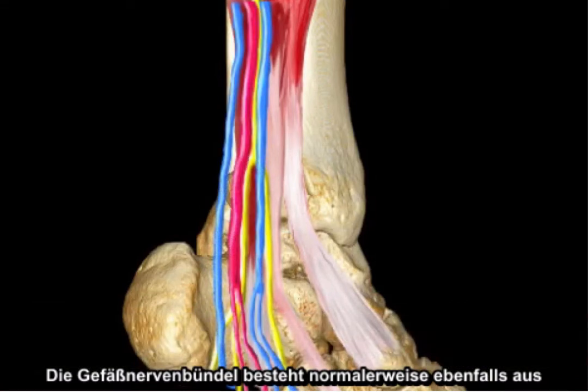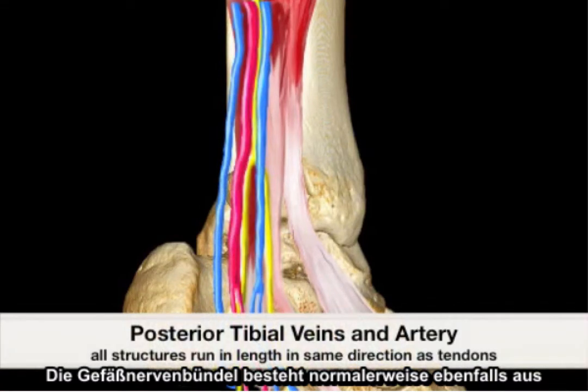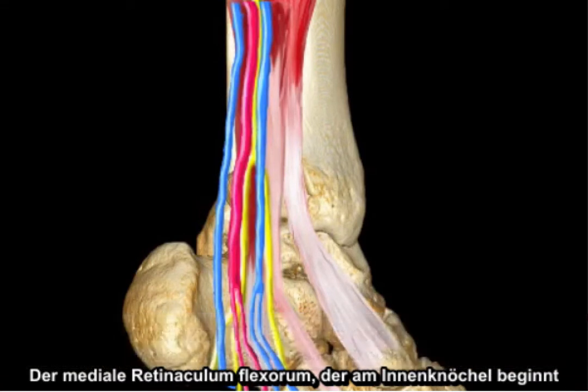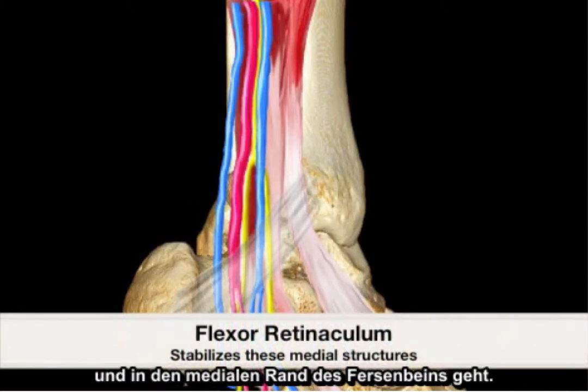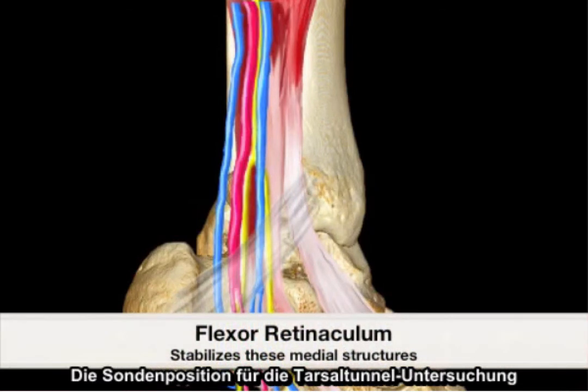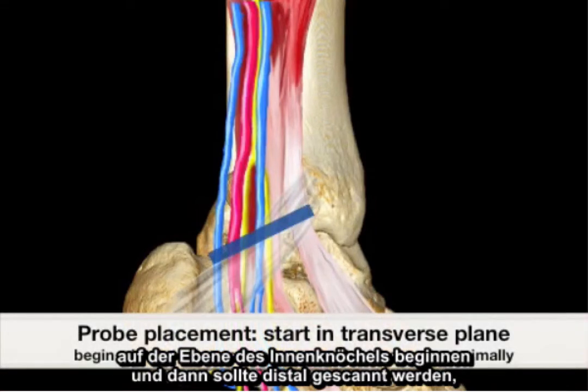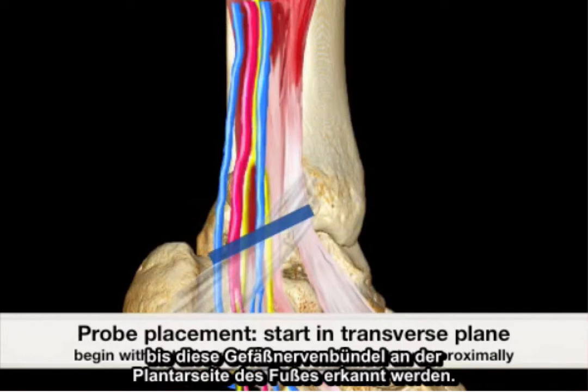The neurovascular bundle also consists of typically one artery and 2 to 3 veins. The medial flexor retinaculum begins at the medial malleolus and inserts to the medial margin of the calcaneus. Probe position for the tarsal tunnel study should begin at the level of the medial malleolus and scanning distally until this neurovascular bundle is traced to the plantar aspect of the foot.